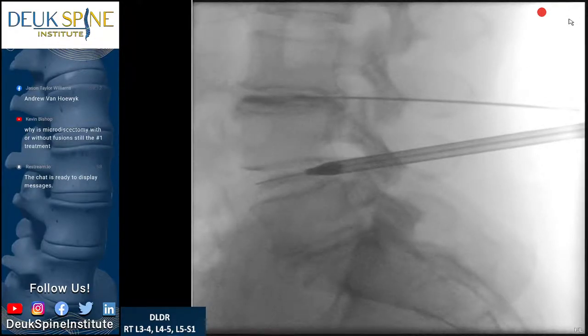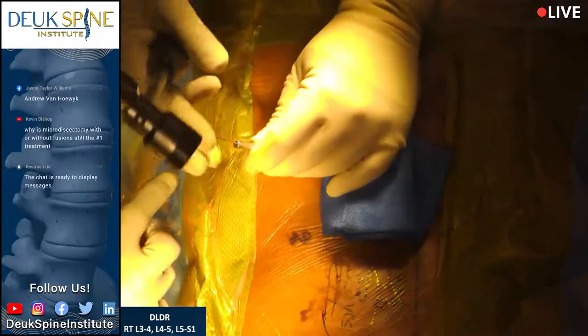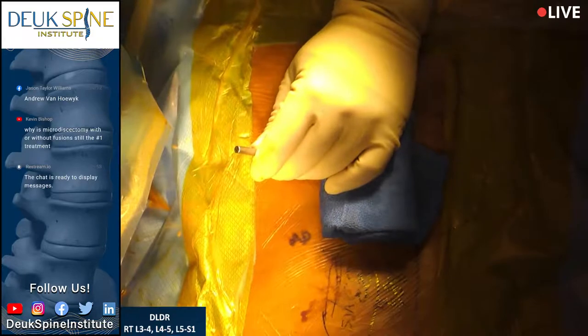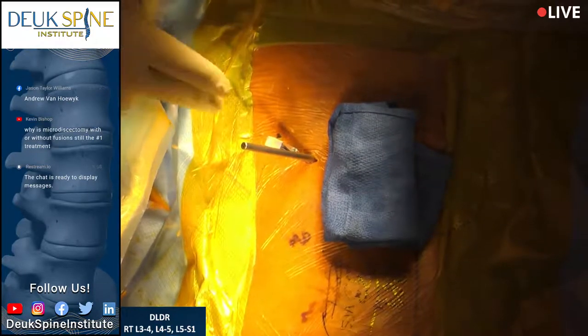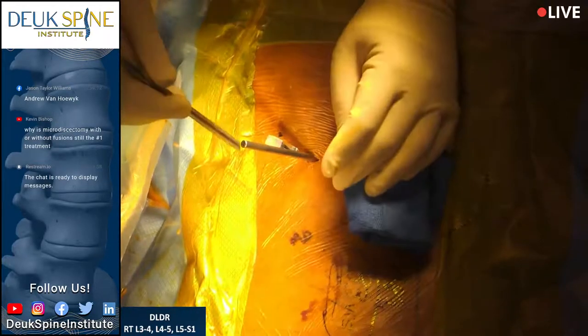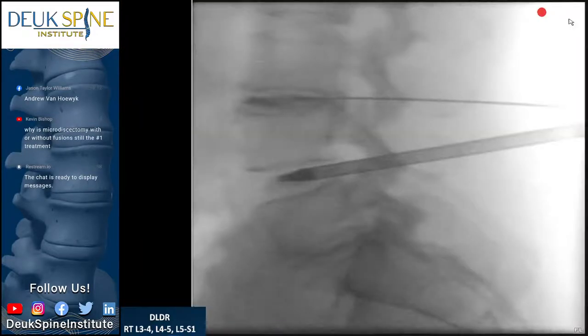Whoops. Shot. So we're inside the tear. Take this. Shot. What I've done now is I've used the dilator to literally push the herniation back inside the disc, where I can go find it and take it out safely. And while I'm taking it out, I'll move the tube backwards, and I'll clean up the annular tear. It's called an annular debridement. So that will allow the disc to heal.